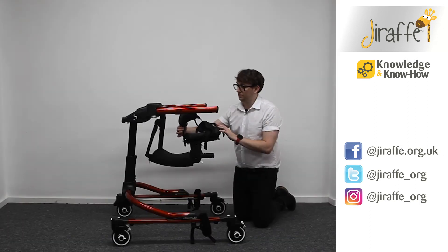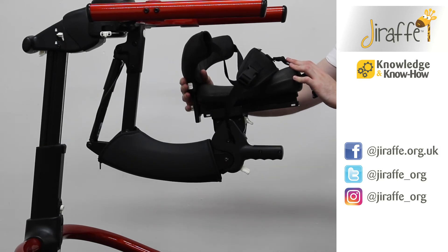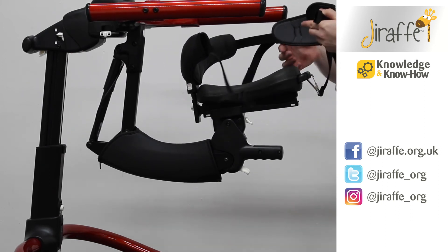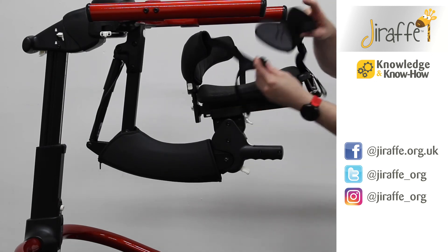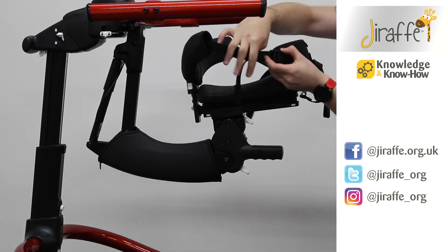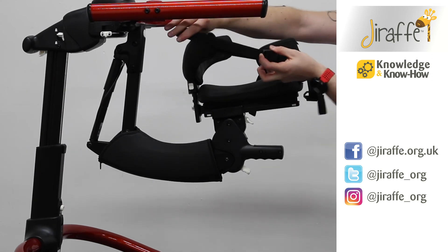We've got a hip corral with a white button here where we can set the height of that corral wherever we need it to be. And then some safety straps supporting the back of the sacrum with two clips to keep the user nice and secure on the saddle. We can tighten or loosen those straps on the side.